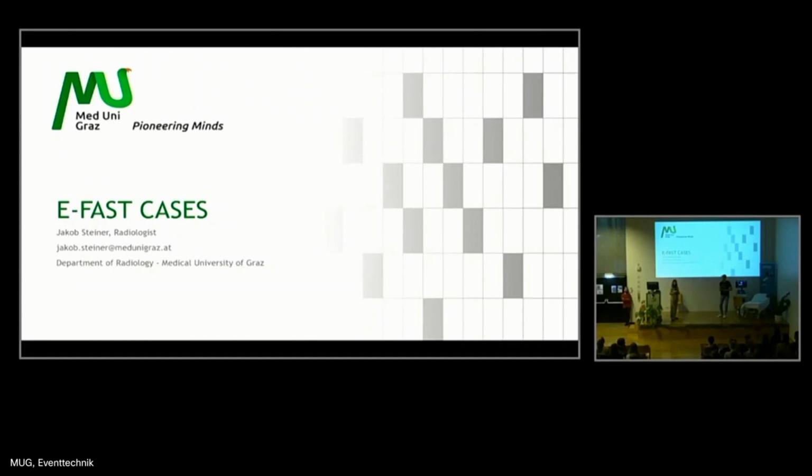Okay. Please. Yeah. Okay, I will repeat the questions. I thought that you wanted to repeat them. And the question was how often you do this examination, the eFAST protocol, if you do it with every patient.